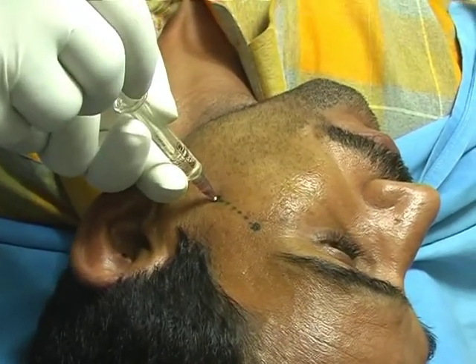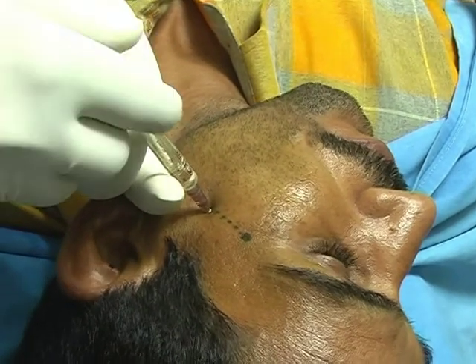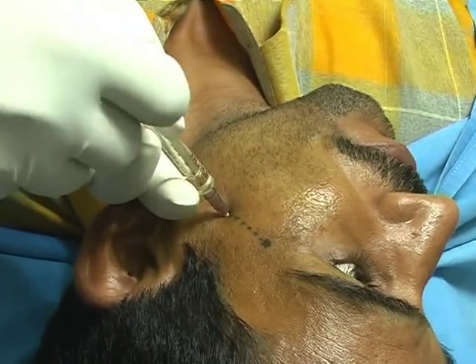So I am infiltrating the skin and the subcutaneous tissue, going down.